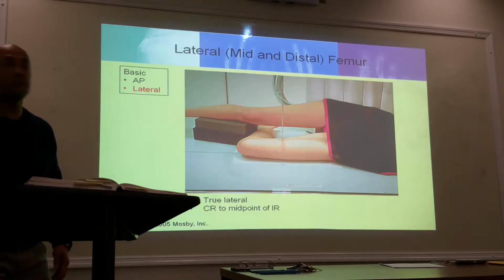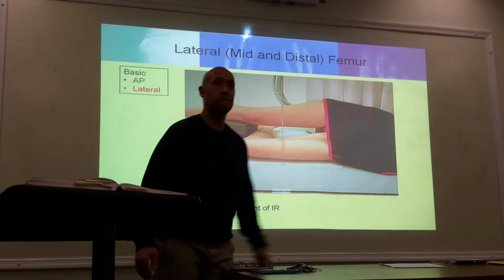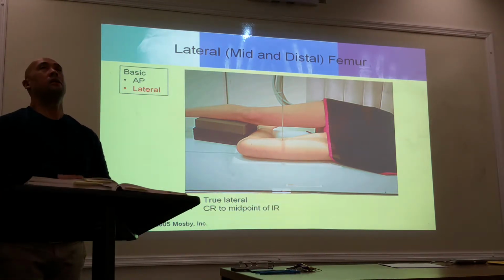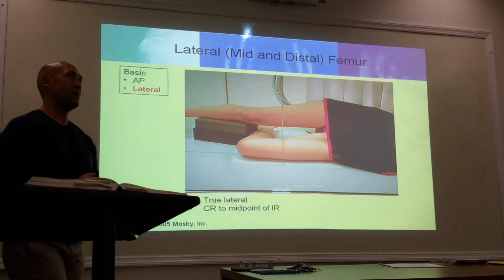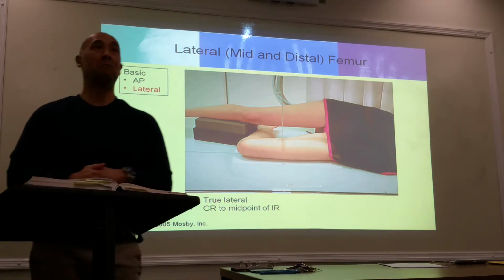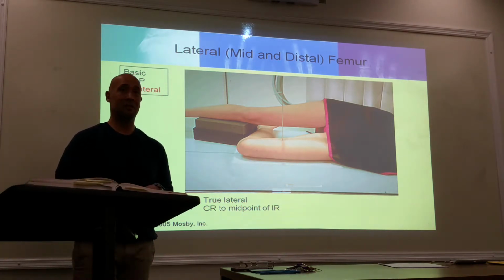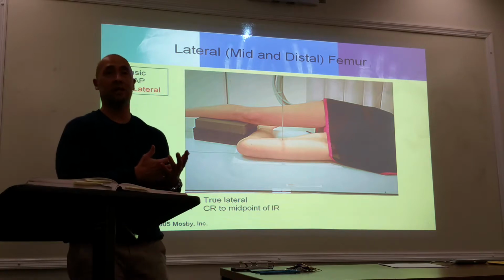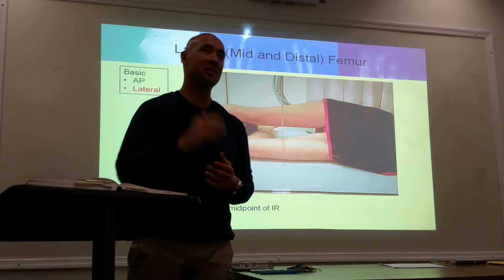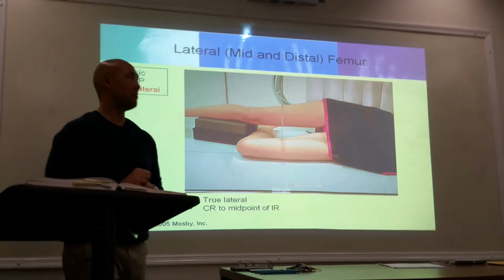Because that's in a Bucky now, you can't angle the collimation. I'm not quite sure. I think it depends on the setup of the room. I know that you can't do it in the front room because it has to be communicating with the detector. In the back room, I think you can bypass that. So it depends on the setup of the room.